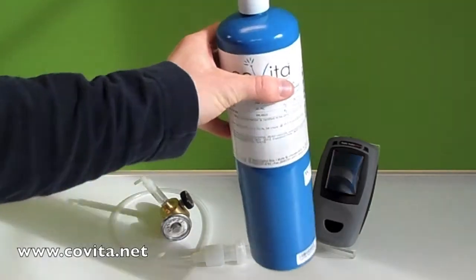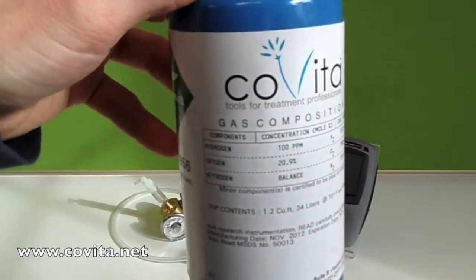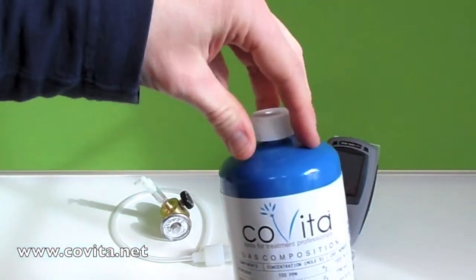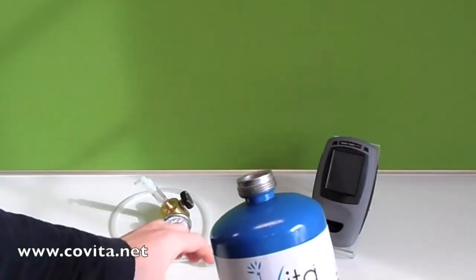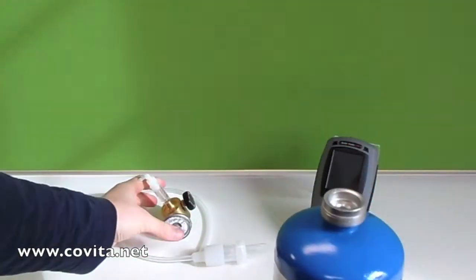Before getting started, it's always important to review the calibration canister to ensure it is in fact 100 ppm hydrogen (H2) calibration gas. The first step is to remove the dust cap from the canister. You'll want to keep a hold of it and replace it when we're done calibrating.